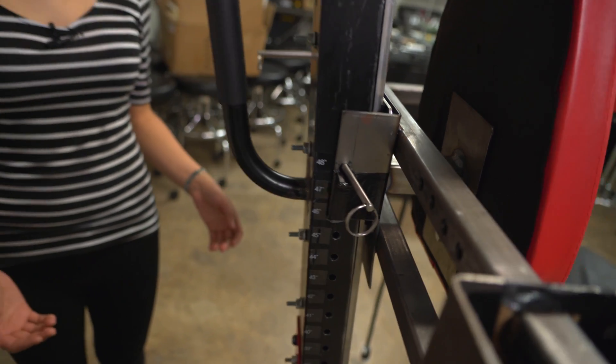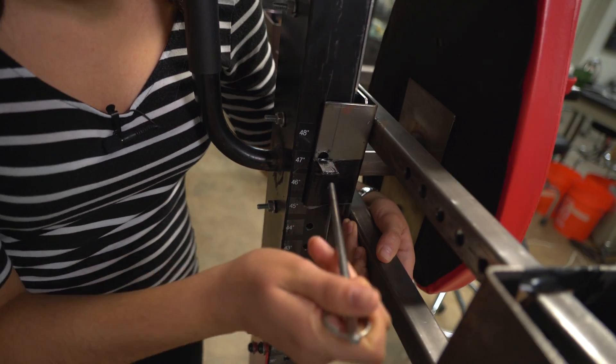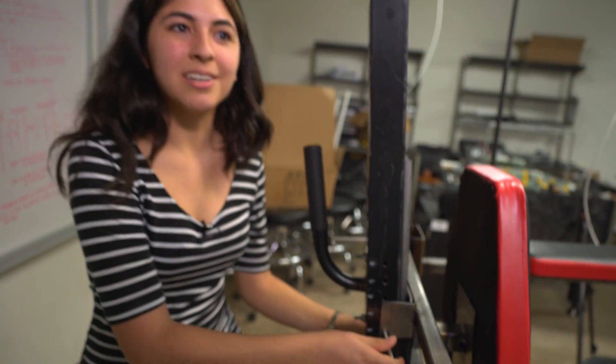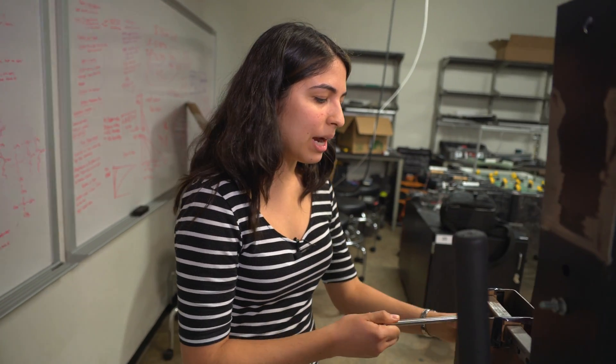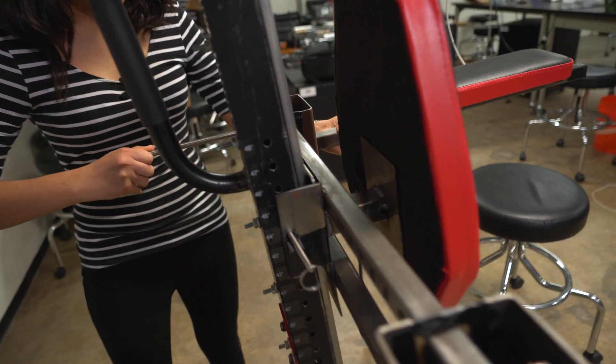Our machine is based on an exercise machine which we modified to make it adjustable in both height and width. We used steel bars to make it adjustable, and as you can see, you just lift it and guide it down the track and it goes right through. We have the same sort of mechanism for the arm rails, where you just move it across the bars and put it back in.